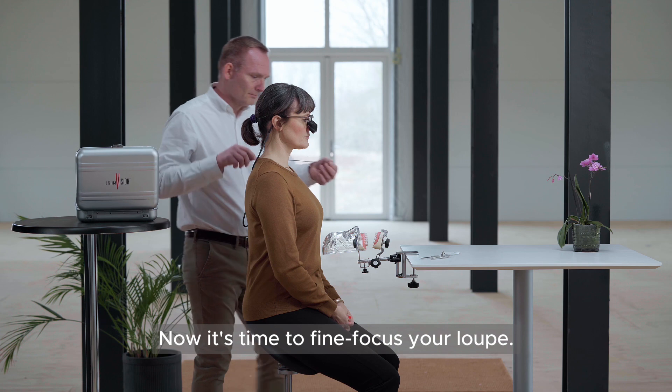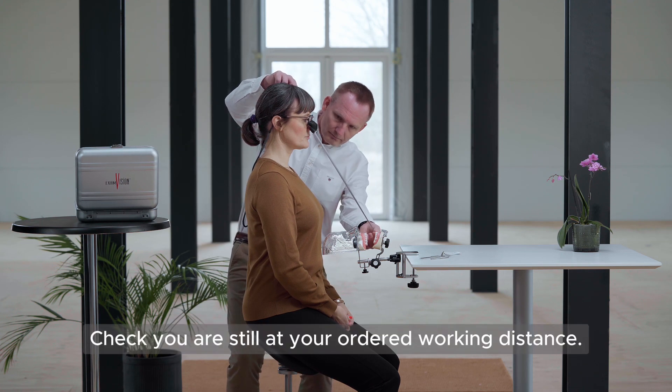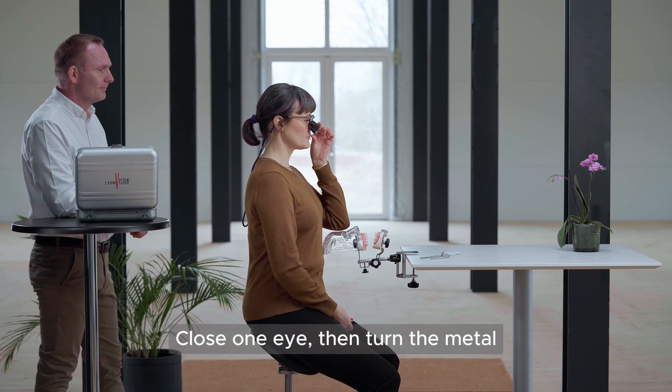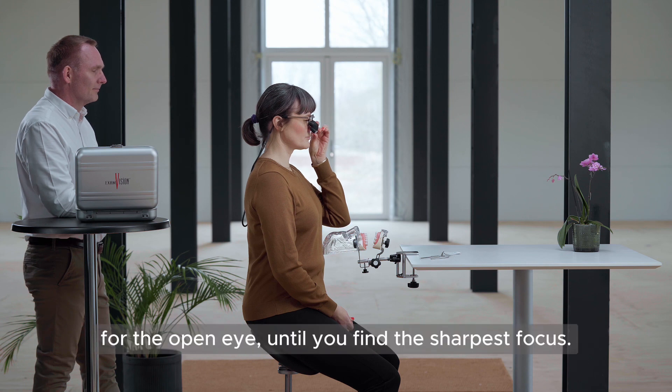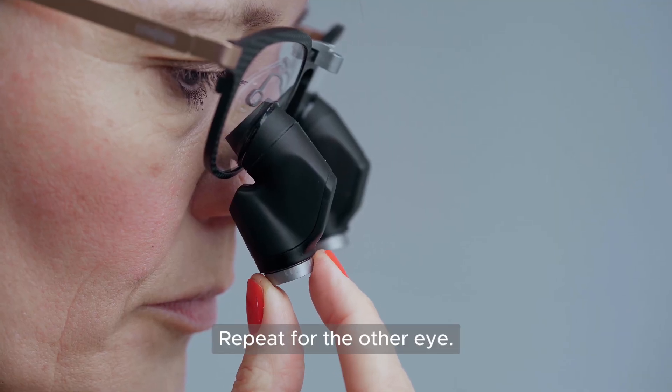Now it's time to fine focus your Loop. Check you are still at your ordered working distance. Close one eye, then turn the metal fine focus ring at the front of the loop for the open eye, until you find the sharpest focus. Repeat for the other eye.